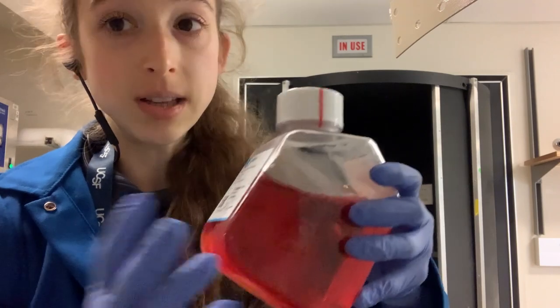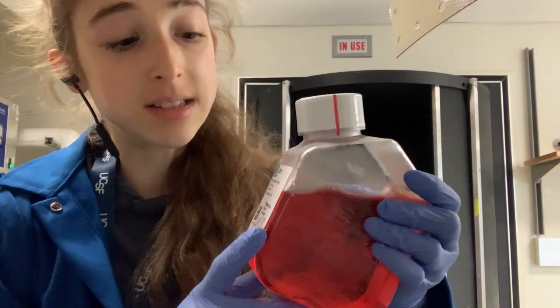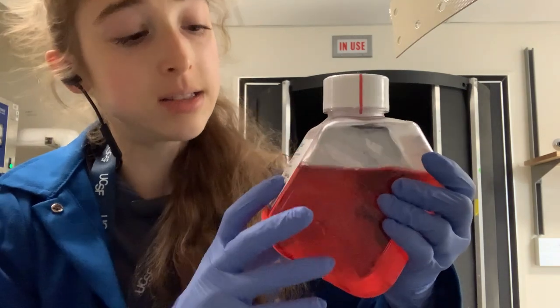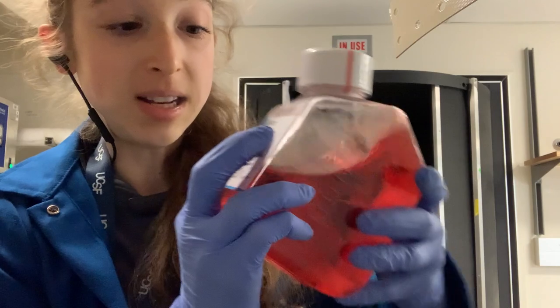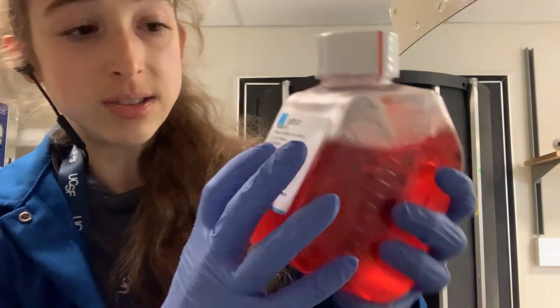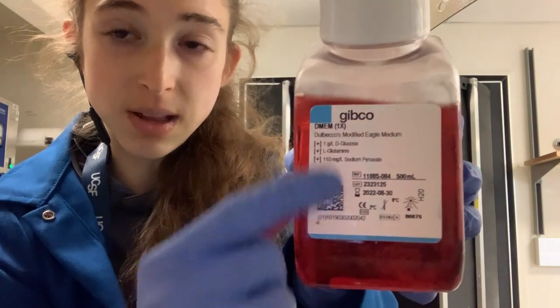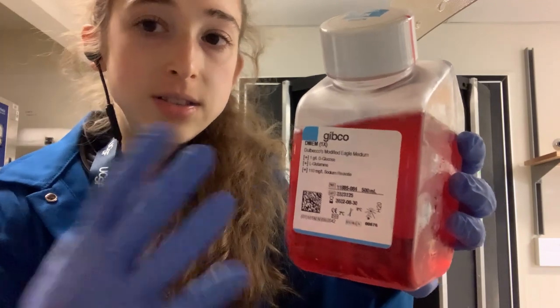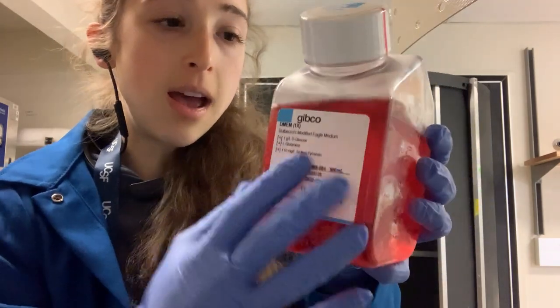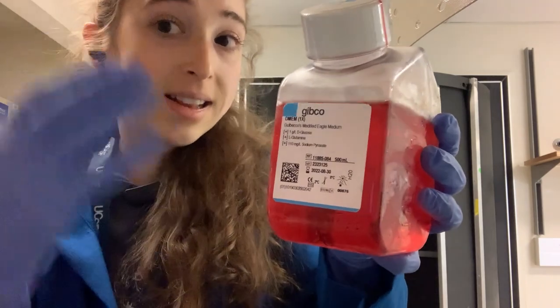For example, one of the common ones we use to culture basic cells, like HEK cells, is DMEM — Dulbecco's Modified Eagle Medium. When you look at one of these bottles, you'll often see a plus-plus, or a plus-plus-plus, or a plus-something. This is because there are different formulations, and some things come already supplemented while other things you add later.